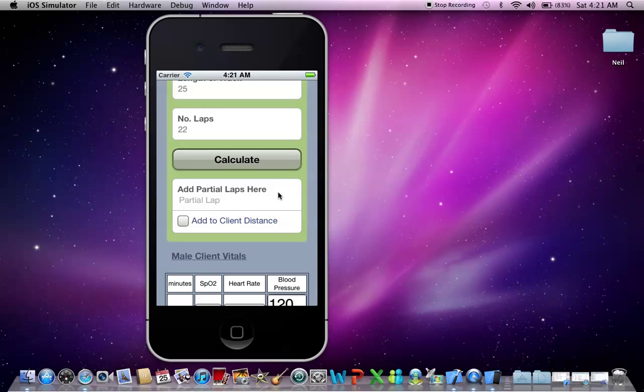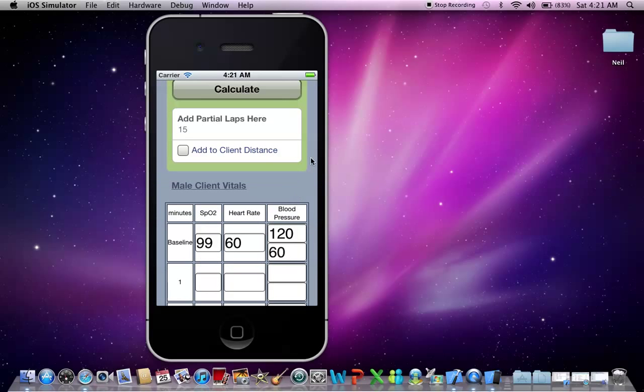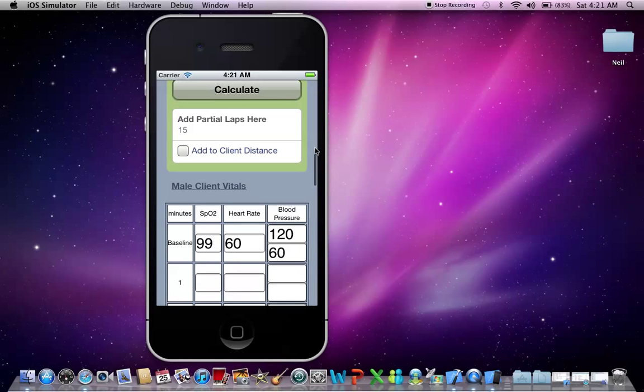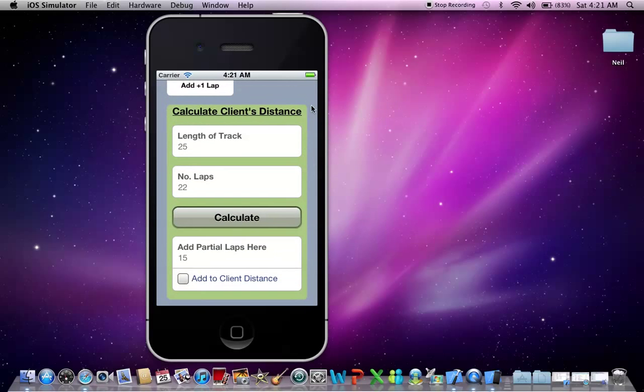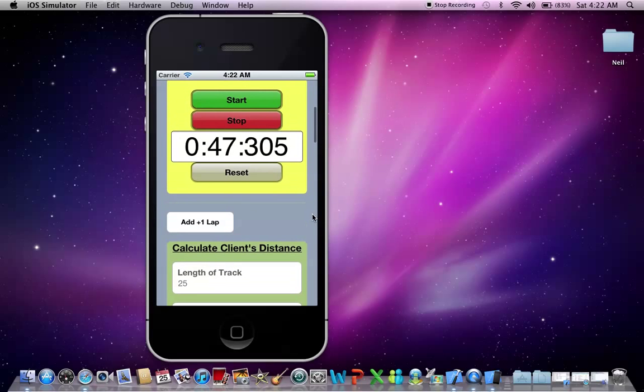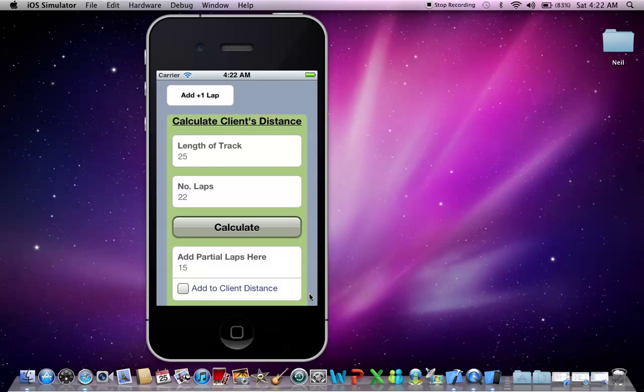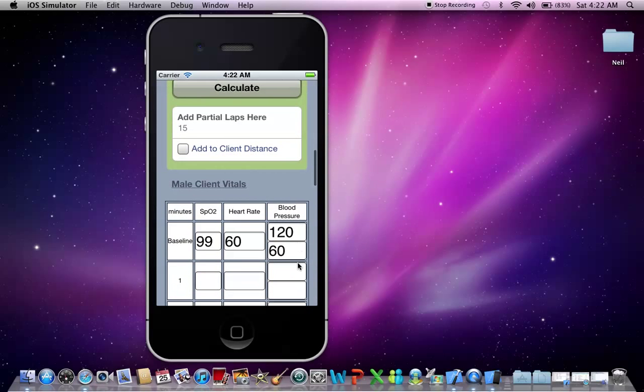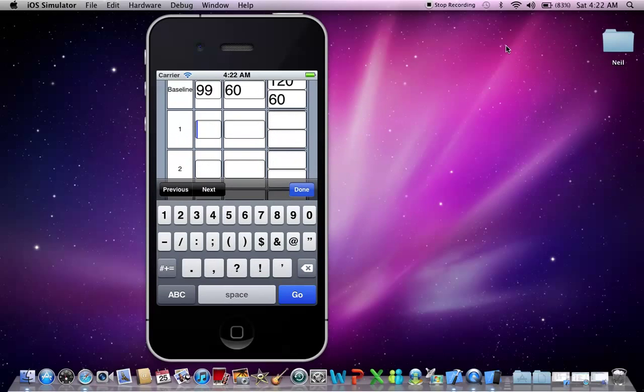Okay, now let's say your client stops in the middle of track and only does 15 meters. So you can add that in as a partial lap meter there as well. Okay, so now I'm not going to wait for the stopwatch to clock over to one minute to put all the values in. Rather, for this example, I'm going to put in all the values in just to see how the report works.